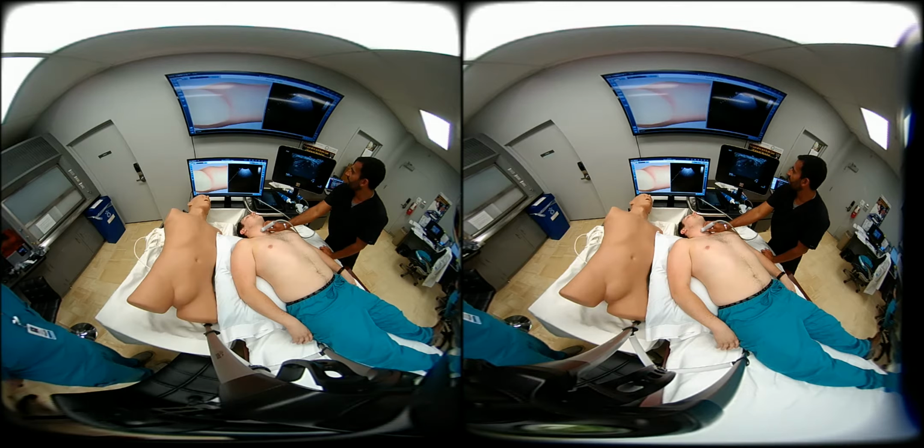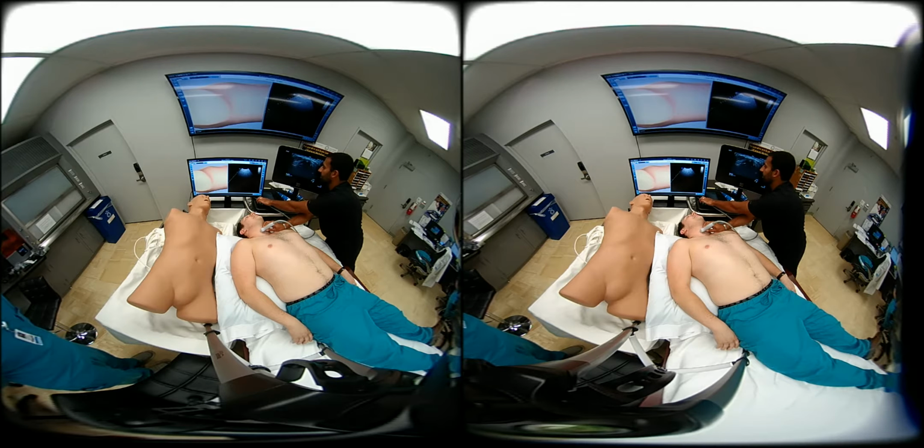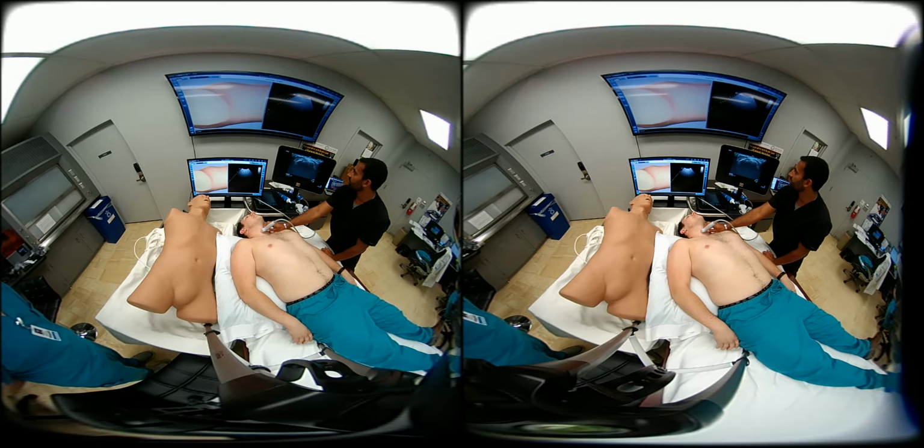We can even ask our subject to say E, and you can see the motion of the vocal cords quite nicely in this picture. One more time if we say E. So again, just scanning in a caudad to now cephalad direction, we can see the various structures. And as you practice this in the transverse approach, you can identify all the anatomy, including the cricothyroid membrane.